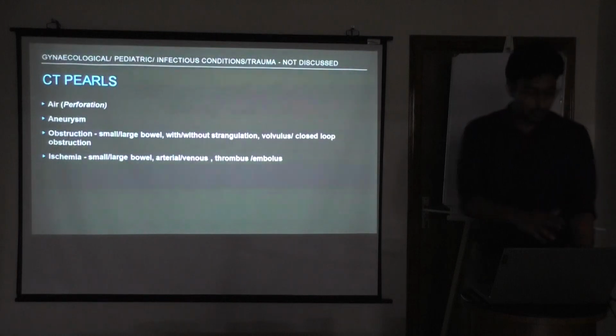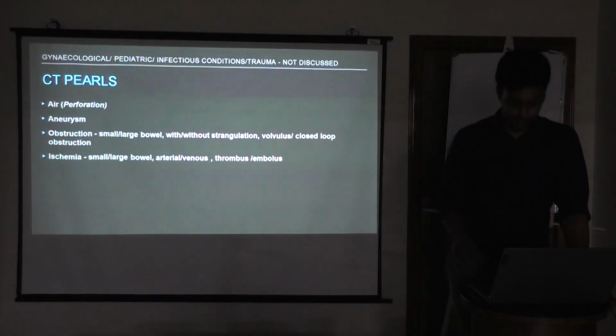And aneurysm, it's not my topic, but it's an emergency which you can't postpone. That's why I'm discussing aneurysm, but I won't go into detail about it. And obstruction, small bowel or large bowel.